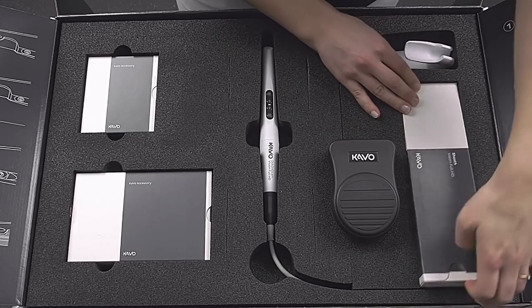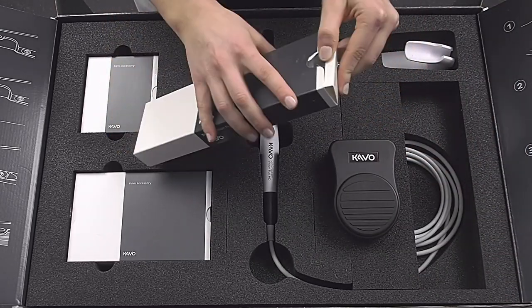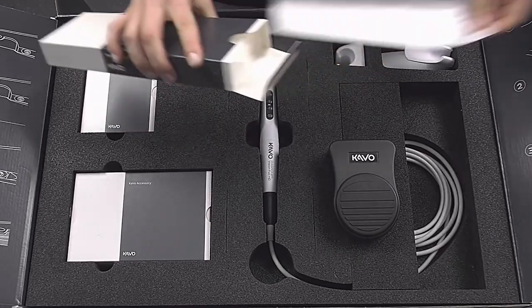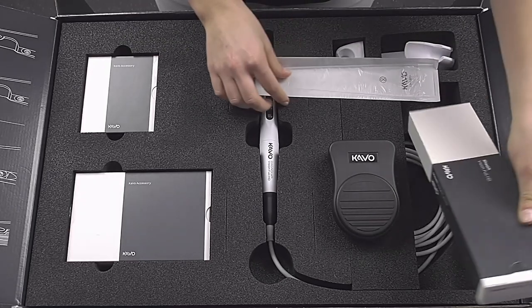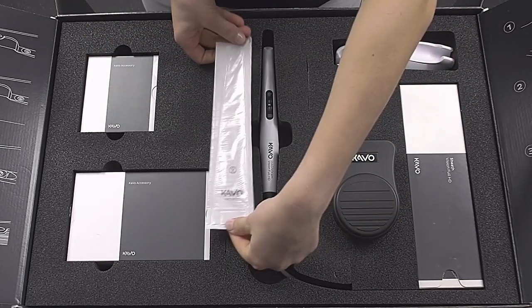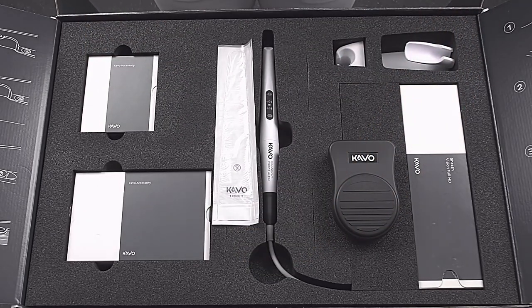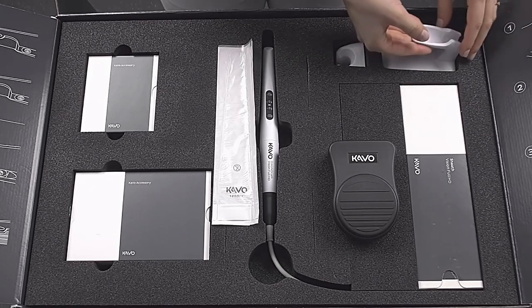To protect the camera from contamination during treatment, a disposable protective cover is placed over the handpiece. The tip and the fluorescence cover can be placed over it as usual. Both the tip and the fluorescence cover are reusable and can undergo a thermal disinfection process and sterilization at up to 135 degrees. After the disposable protective cover has been removed, the camera handpiece can be cleaned and disinfected with CAWO-approved disinfectants.